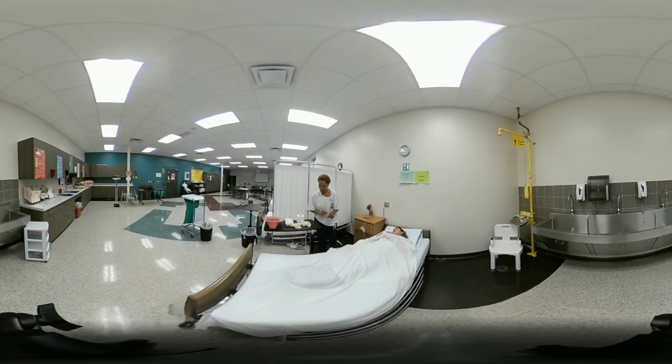The first thing to do is make sure the client is in a supine position, meaning the head of bed is lowered. The head of bed is already lowered, so I'll verbalize that. Now I'm going to put on my first pair of gloves and get the bedpan.